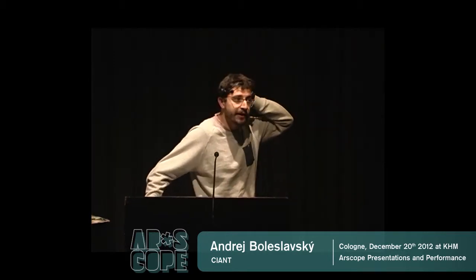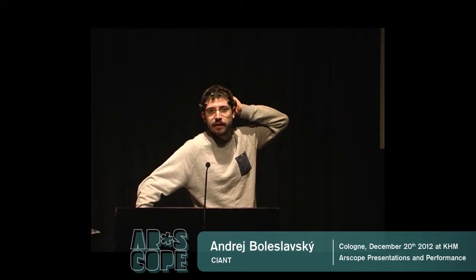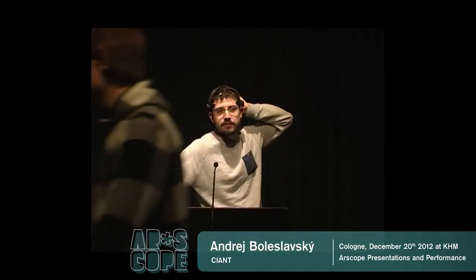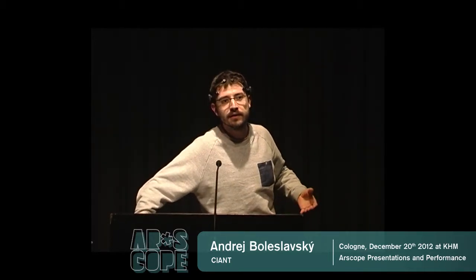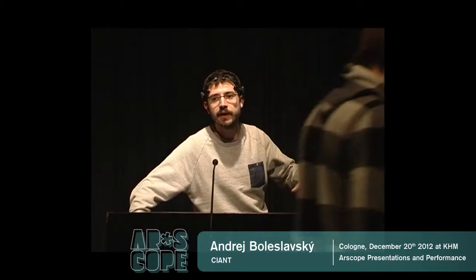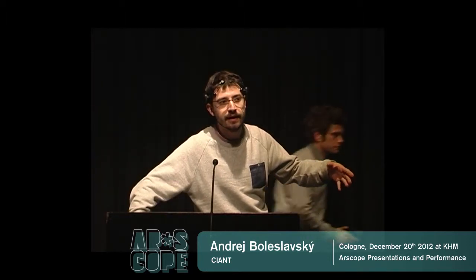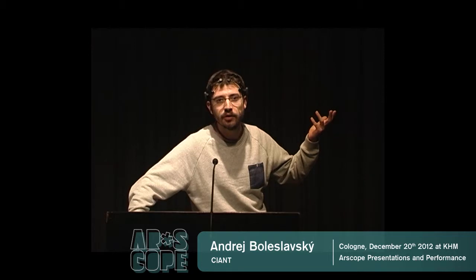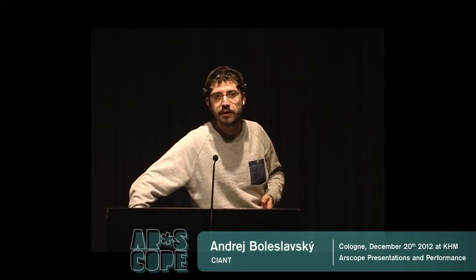So as you can see, I already have on my head attached the brain-computer interface from a company which is called Emotiv, and this is probably the most famous consumer level device. As Pavel showed during his presentation, the brain-computer devices and the biofeedback devices are usually meant for medical use, and they are expensive. They have to be in a controlled environment. And this one is actually meant for home experiments and for controlling computer games. And many researchers use this as a cheap and available tool to work with brainwave data.